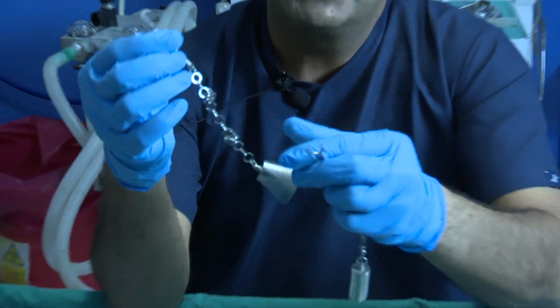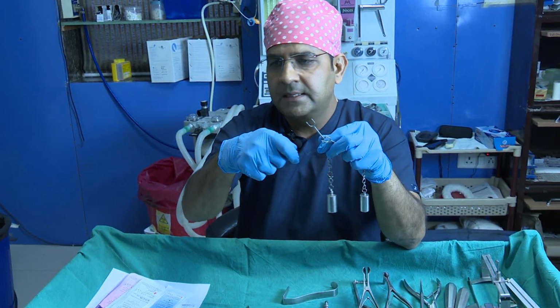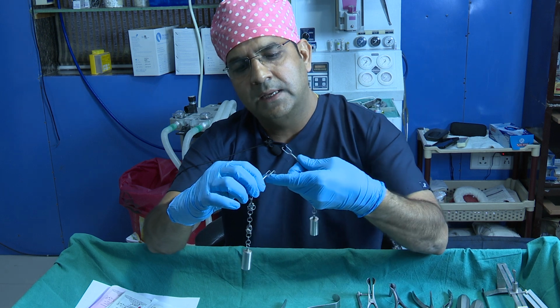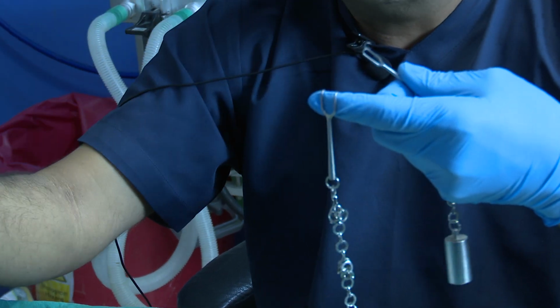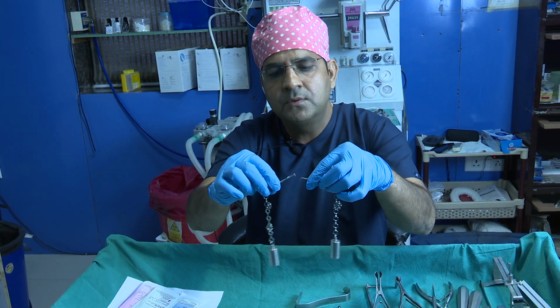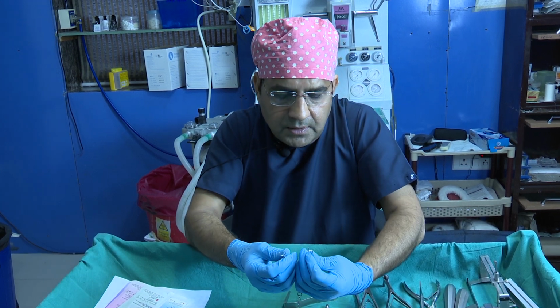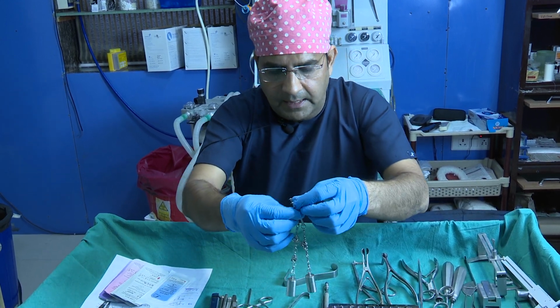Look at this lateral crura retractor. Usually we just retract the lateral crura with a mosquito forceps, and sometimes we struggle. So the advantage of this one is that you can just pass it like this, and it is very good for retraction. So we can use it like this. This device is by Najim Circus, and I think by Marina Medical. So if you find Marina Medical, then you can find this instrument, the lateral crura retractor.